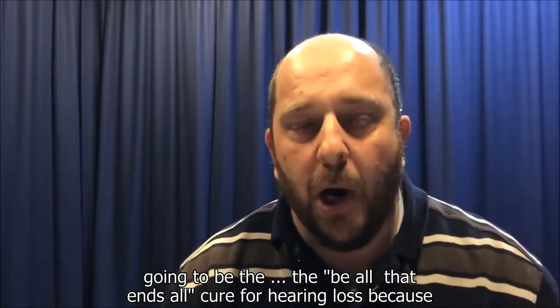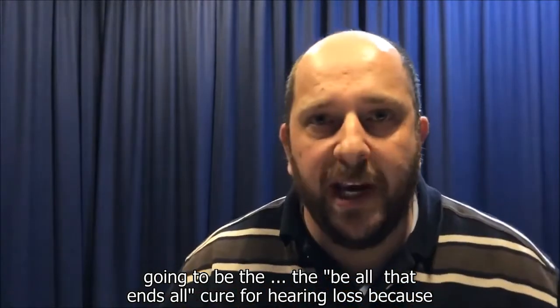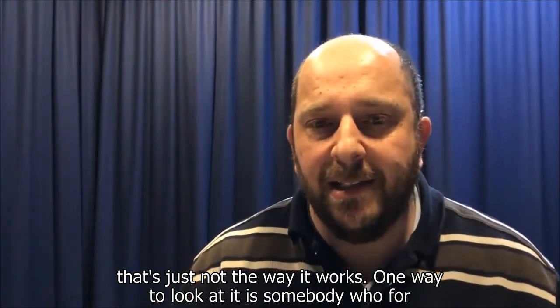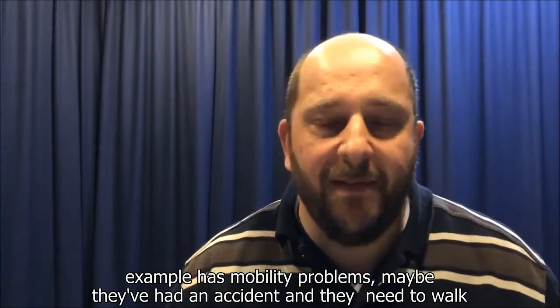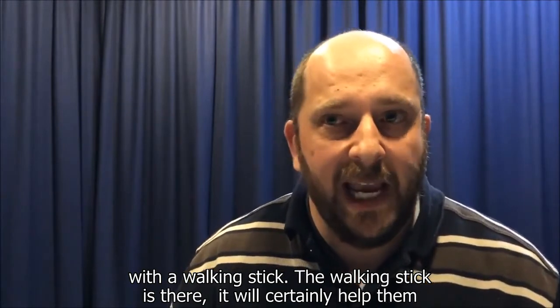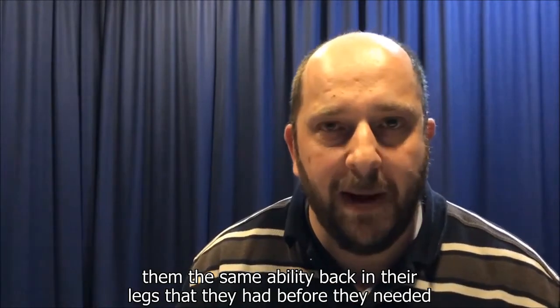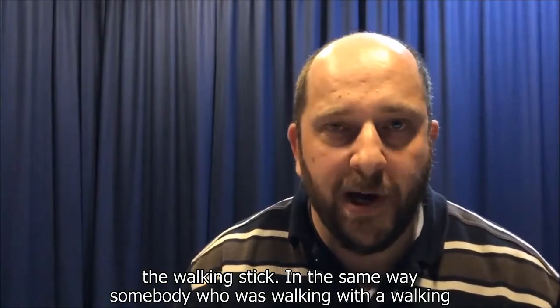They're certainly not going to be the be-all and end-all cure for hearing loss, because that's just not the way it works. One way to look at it is somebody who, for example, has mobility problems. Maybe they've had an accident, they need to walk with a walking stick. The walking stick is there. It will certainly help them walk. It will make it a bit easier for them to walk, but it's not going to give them the same ability back in their legs that they had before they needed the walking stick.